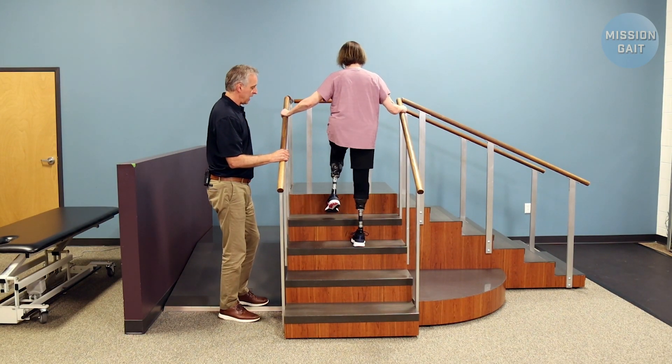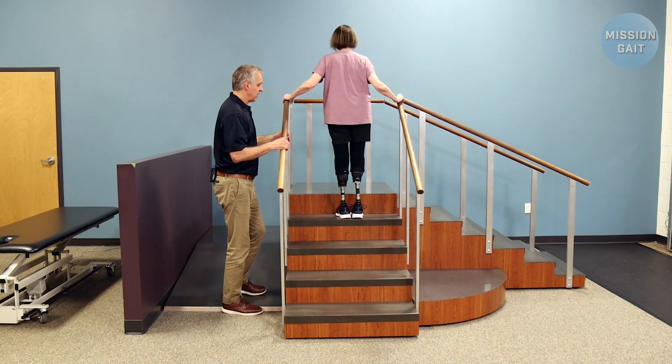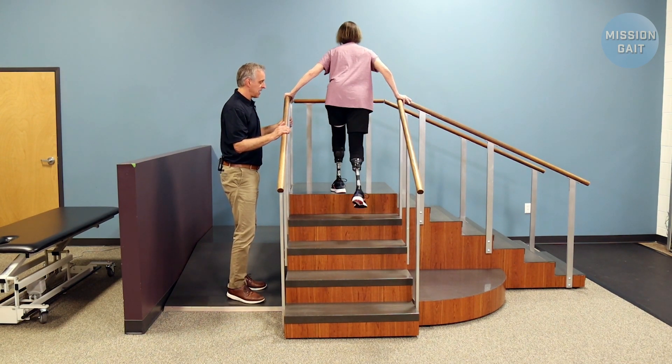There you go — and all the way up. Perfect. Make sure that toe doesn't drag. Clear the step. Perfect.